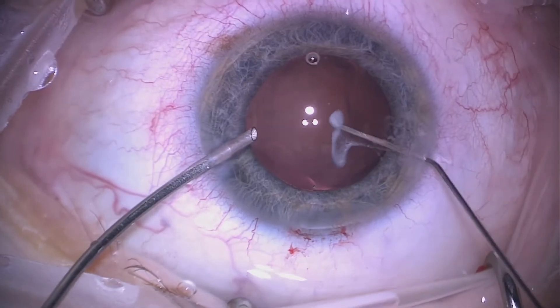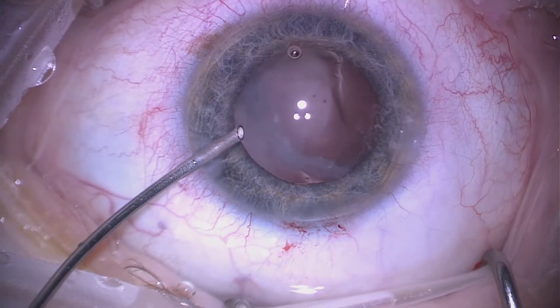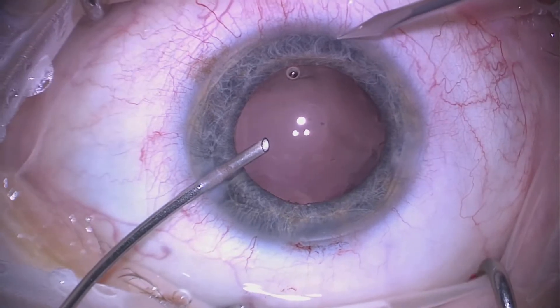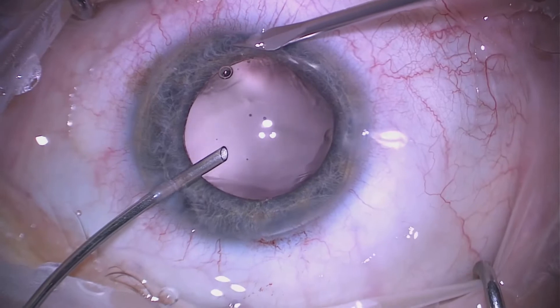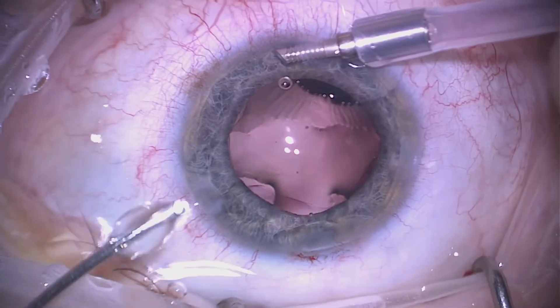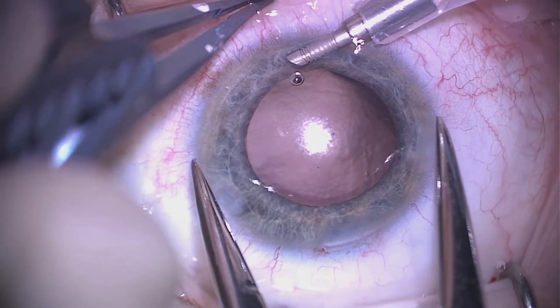Once we feel we've completed the vitrectomy, we use some Triamcinolone, and it is obvious that we've removed the vast majority of the core vitreous. We then leave the infusion in place, create a further paracentesis, and insert a Lewicki cannula — this is very useful to maintain pressure within the eye as we perform further maneuvers.